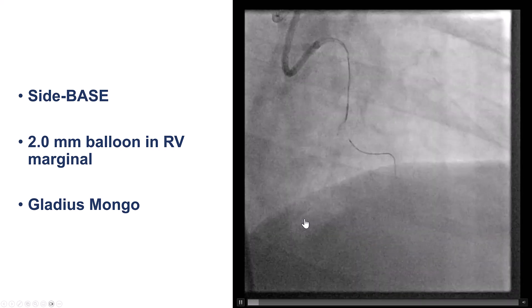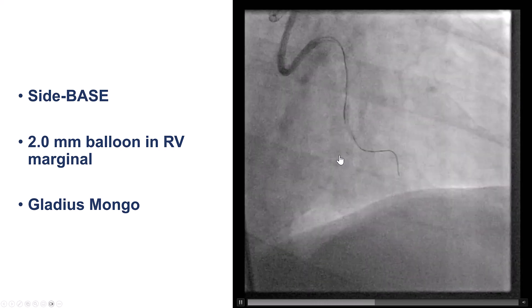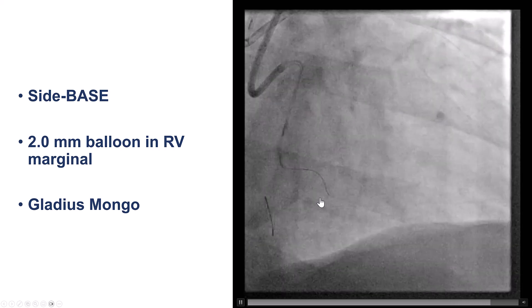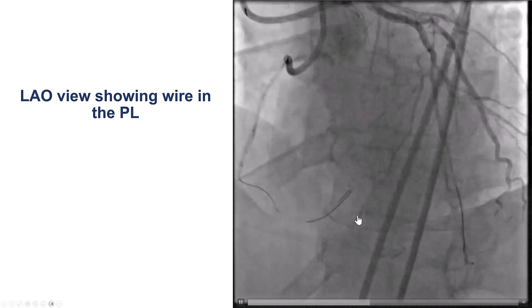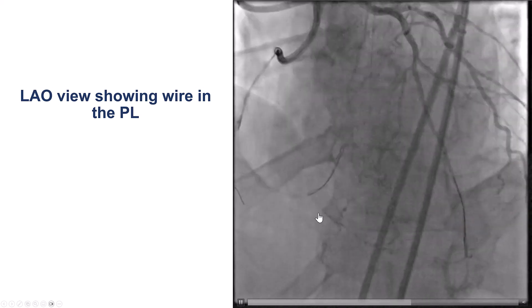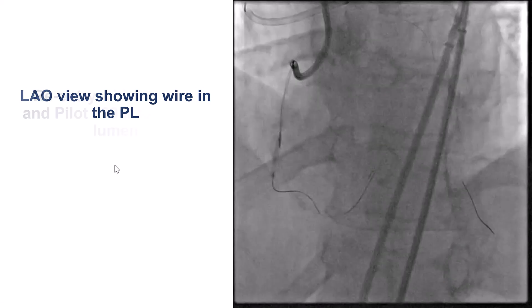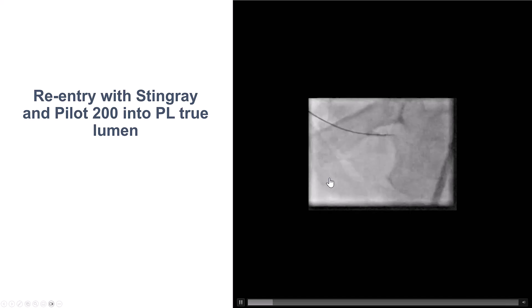The wire can then follow the course of the vessel. In this case, a Gladius Mongo avoids the acute marginal and seems to advance along the course of the right coronary artery. Contralateral injection confirmed there were extra-plaque positions along the vessel architecture, so our next step was to try reentry. We brought the Stingray balloon and tried the stick-and-swap technique with a Pilot 200 wire.